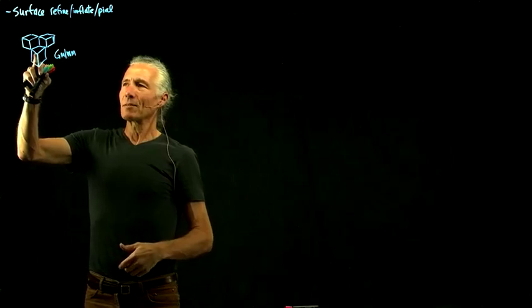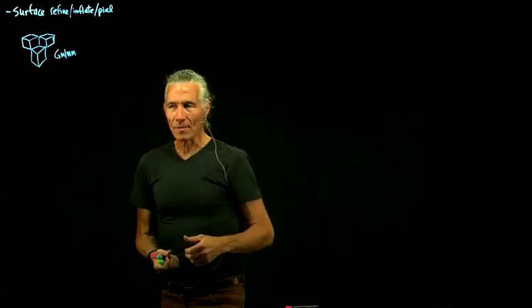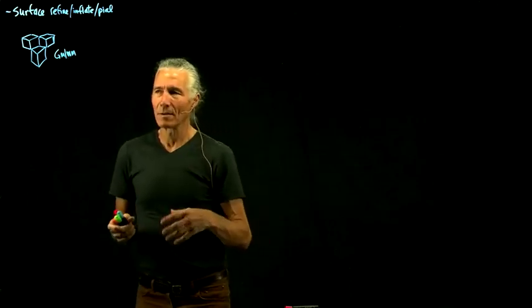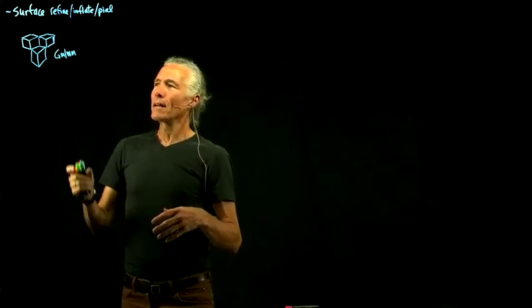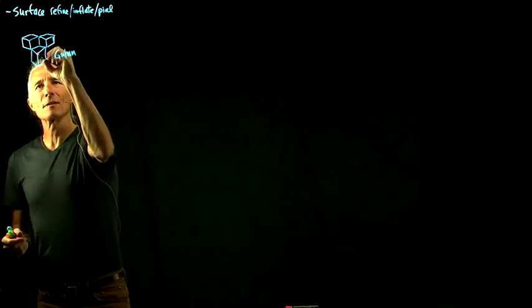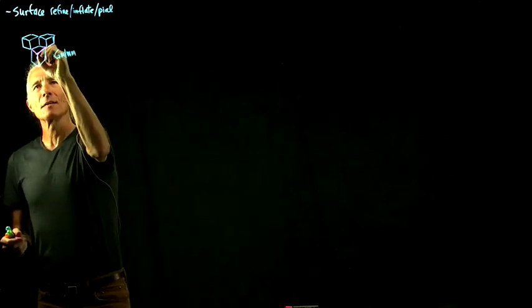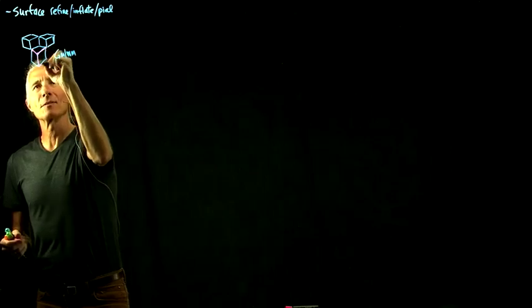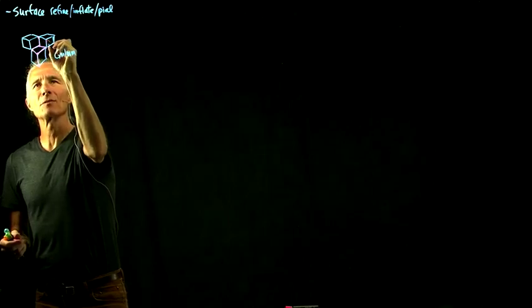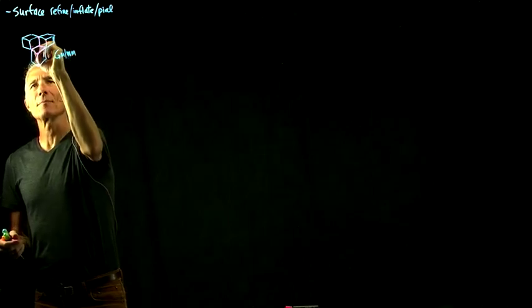But basically, you take that thing, which is a 3D data set. It just says white matter or not white matter, and then you turn it into a surface by finding all the neighbors, so every vertex knows its neighbors.